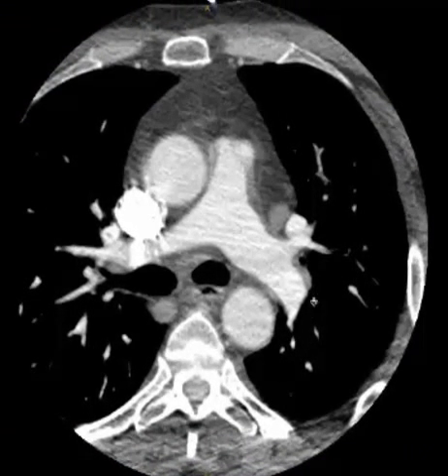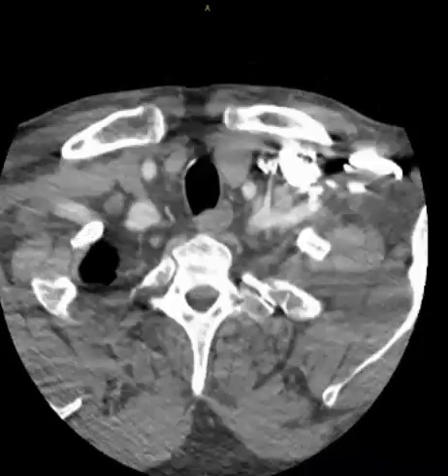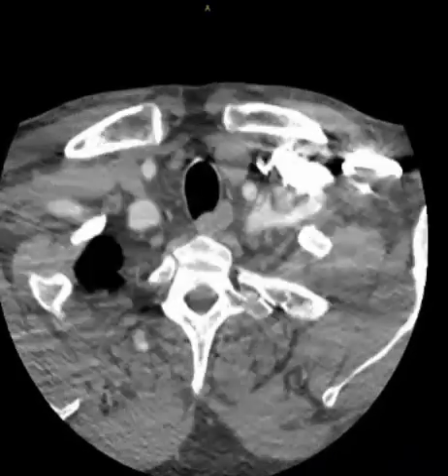Please refer to a separate tutorial for examining CT brain without contrast, which is also critical. When I review a CTA head and neck, I make sure I look at the rest of the body first: the thyroid gland, the mediastinum, the lungs, and the spine. So make sure you check those.